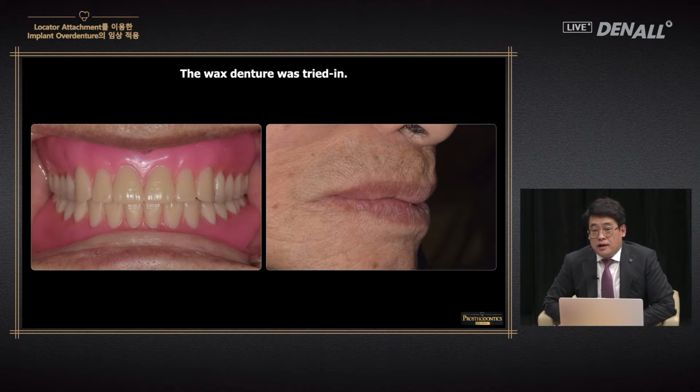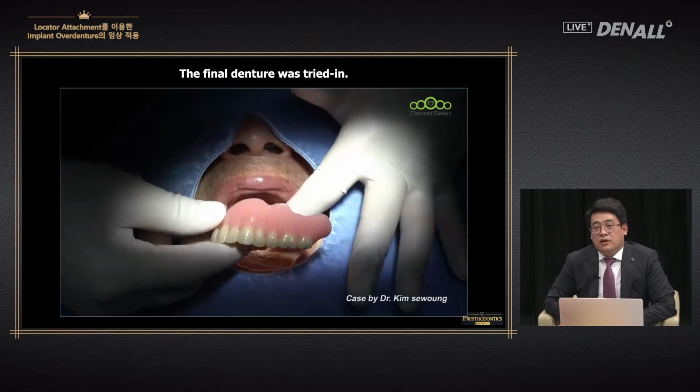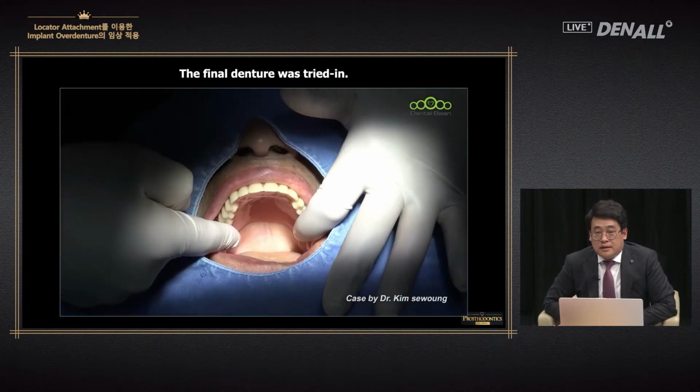Remember to try in the denture and evaluate various factors. After that, you use the general method to process the denture. Once the denture is brought to the clinic, you evaluate the denture in try-in.